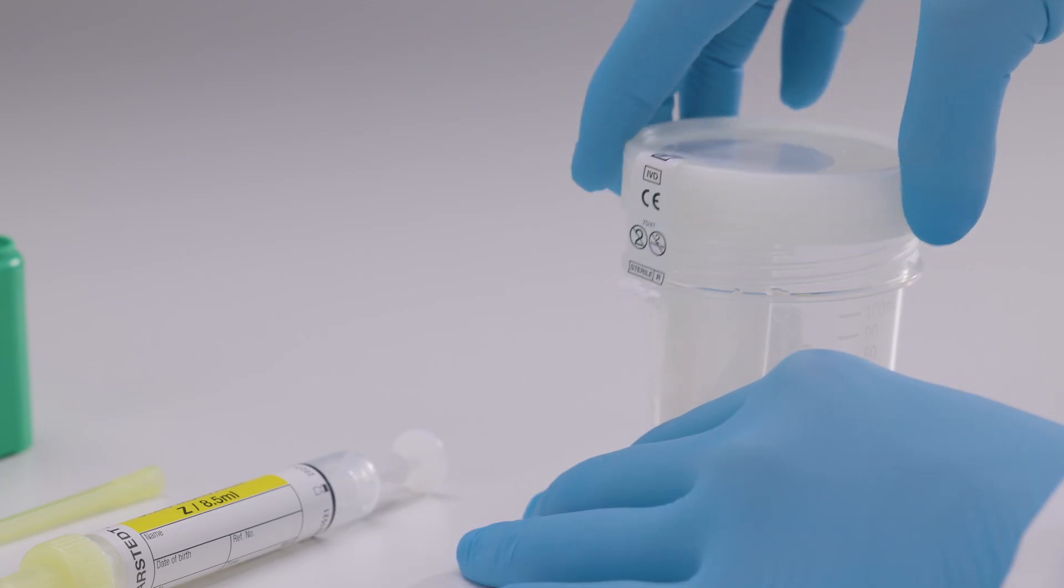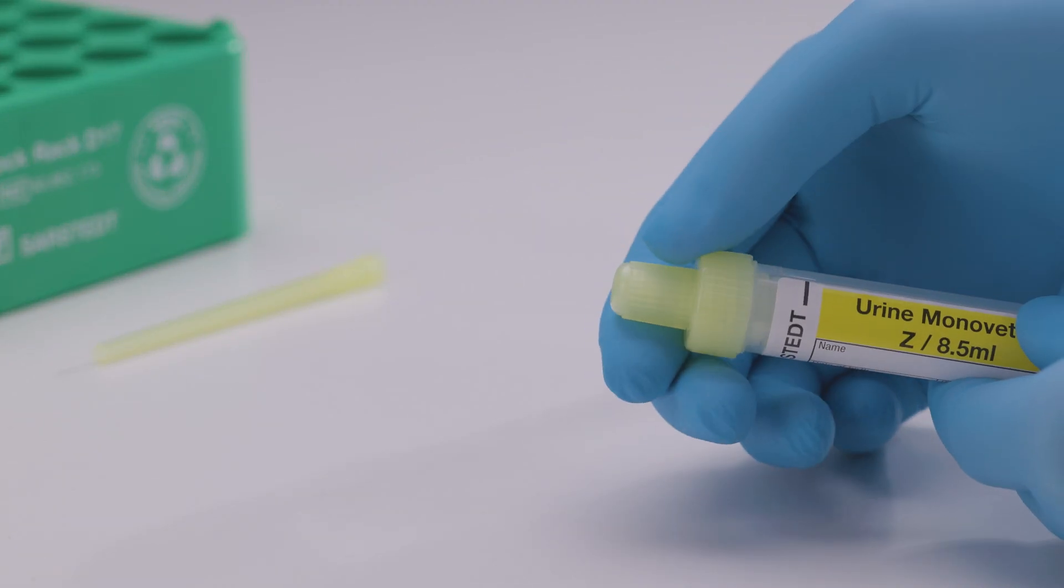Open the NFT cup, remove the stopper from the Urine MonoVet and set it aside.